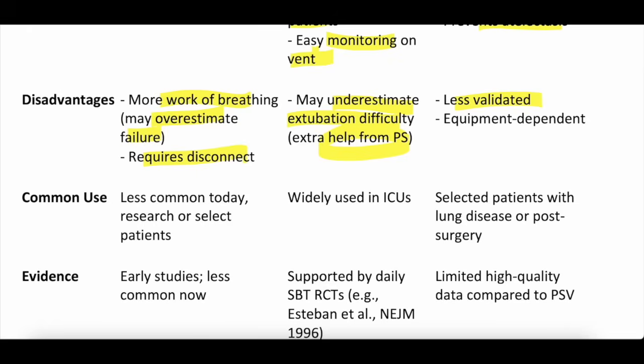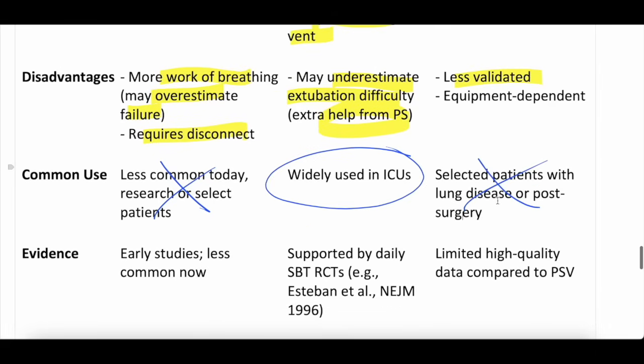Common use, we would say T-piece trials, much less commonly used today. Pressure support trials, widely used. CPAP trials, not commonly used. And then evidence, there's most evidence supporting pressure support trials, much less evidence supporting CPAP or T-piece trials.